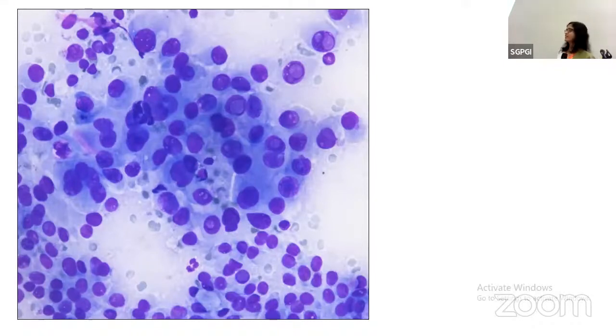Only 2 more cases and they are very easy. Okay. Arey beta, pura describe to karne do.